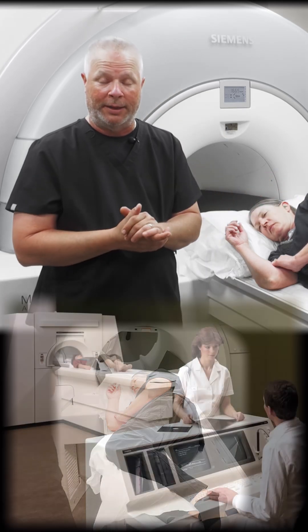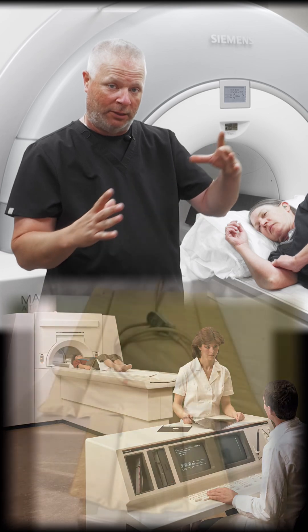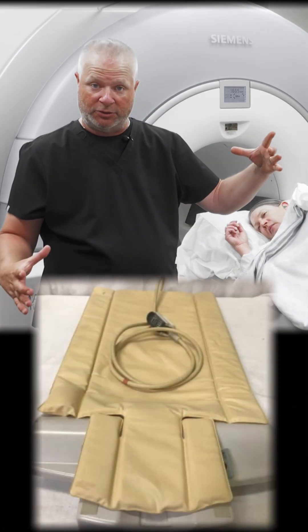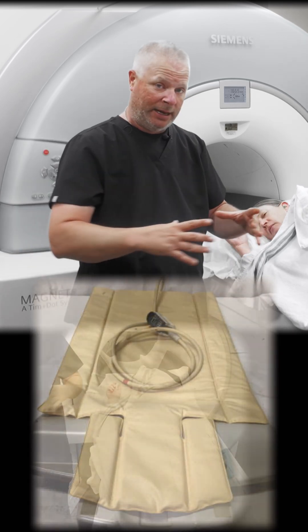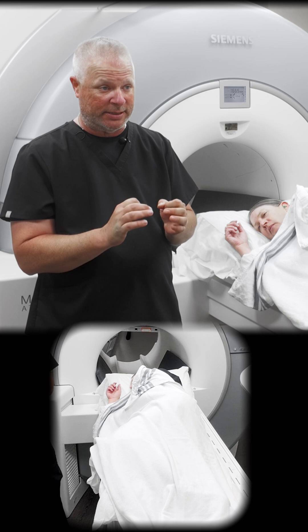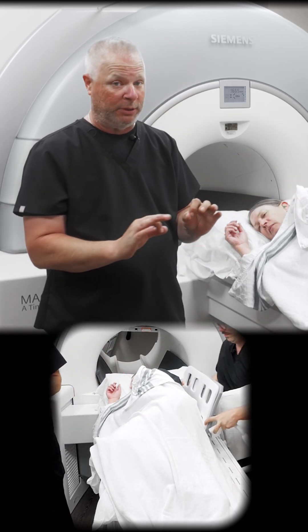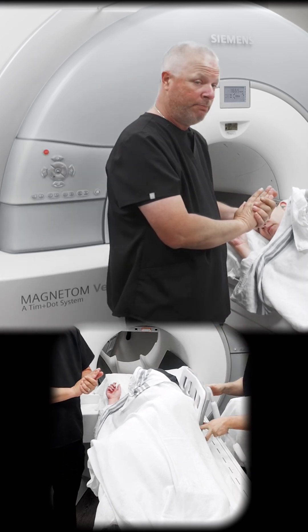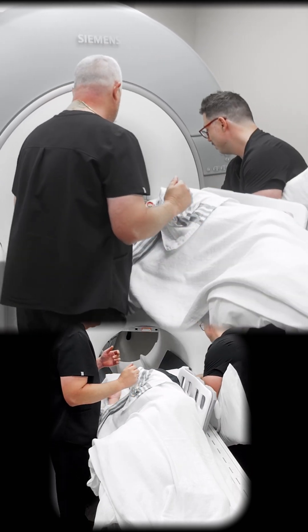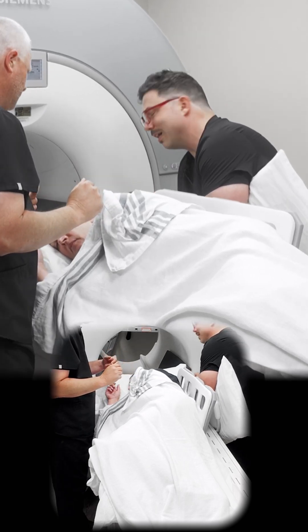If you guys remember back in the day on the old Philips machines, there was that long phased array coil that looked like a big belt strap — we would lay it on the table and the patient would lay flat on it. This is almost the same idea, but now we're using an 18-channel phased array coil, so we're gonna have plenty of signal. We're gonna put that right posterior to their back — it's a great technique.